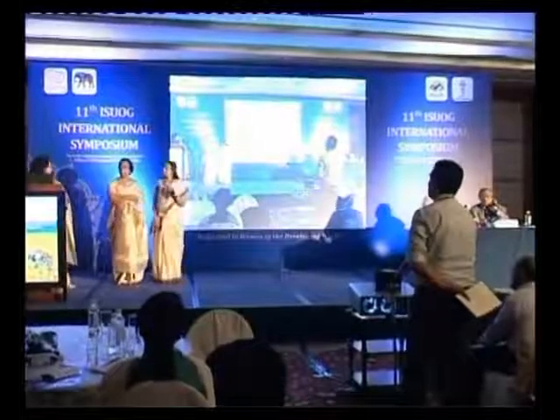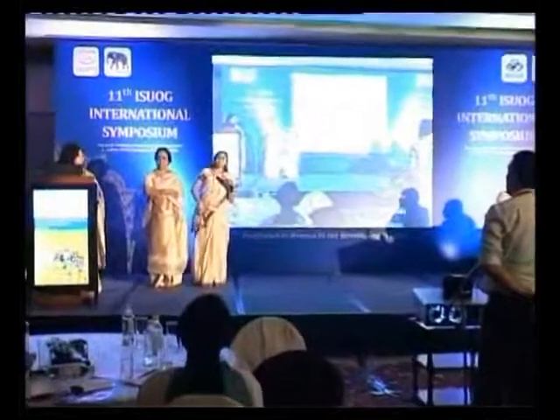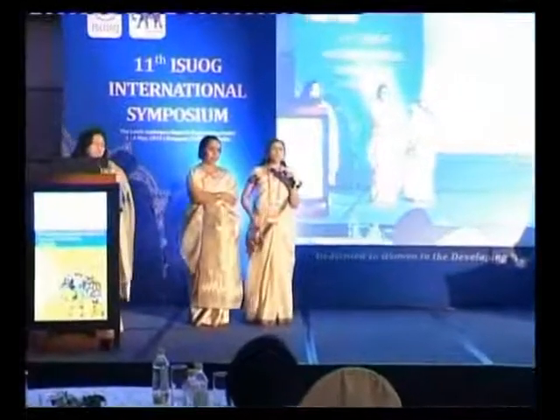But Sonal, for diagnosis, I think it's still important. Even if the volume is normal, I have not shown that presentation to you because that's not the topic, but even if the volume is normal, even if the number of follicles is 12, even if you go to Rotterdam, what does it say? The ultrasound feature of Rotterdam is an ovary which is more than 10 cc and/or has more than 12 follicles, and then two of the three features. That means the ovary may be absolutely normal and still it's PCOS. There may be an ovary which is 10 cc but has fewer than 12 follicles and still it's PCOS. And there's an ovary which is normal size, less than 10 cc, with more than 12 follicles, and then also it's PCOS.